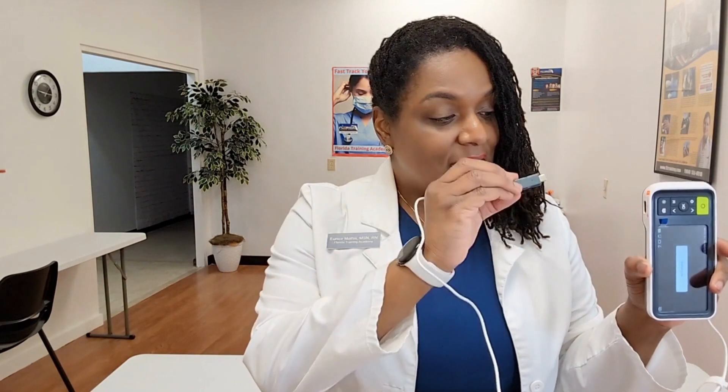So I'm going to connect it now. I do so by simply connecting it into the little adapter port on the side.